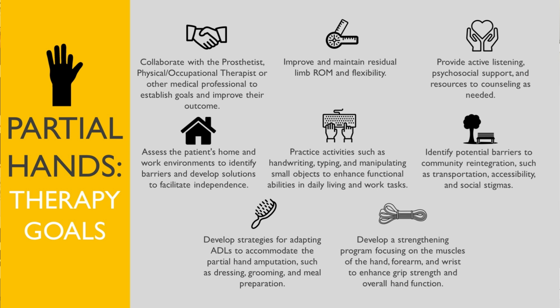We're going to be working directly with the therapist, as Mike already mentioned, to try to achieve some of these goals, looking at range of motion, strength, and essentially for them to apply these devices into real world scenarios. Early on, it might be different goals, such as picking up and moving blocks and working on dexterity, and the i-digits come to mind when you're working on EMG signals and strengthening those signals. But essentially the big picture leads into utilizing these devices, improving wear time and compliance, and making these as functional as possible. That's essentially the end goal.